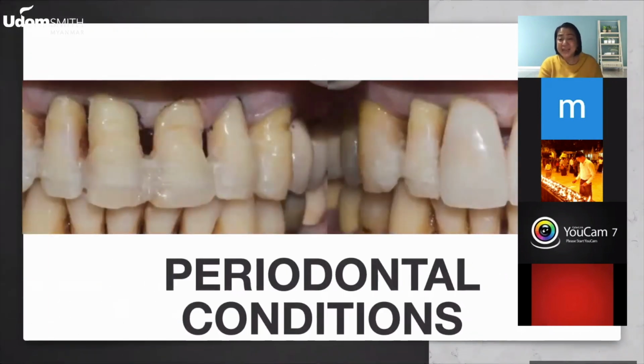Okay, this one is a case that was presented to us when we were training for Edelweiss by Dr. Claudio Novelli. He is the Italian dentist that you also saw in one of the videos that was presented earlier. So in this case, a lot of our geriatric patients or older patients who already have mobility in their teeth, the tendency is we place a splint or fiber reinforced matrix in order to stabilize the tooth first before we do our final restoration.